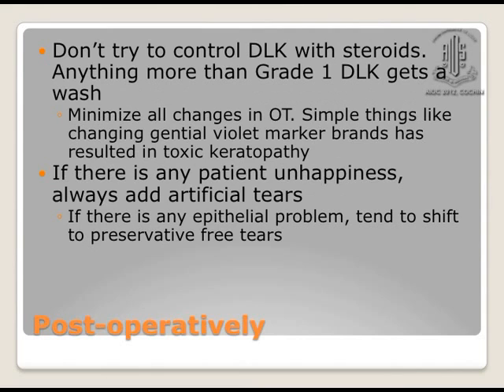DLK, if it occurs, it's not just enough to give steroids. If it is beyond grade 1, it's always a good idea to do a wash and then give extensive steroids. And for avoiding DLK, it is important that you are minimizing all changes in the OT. So simple things like changing gentian violet marker brands has also resulted in toxic keratopathy.